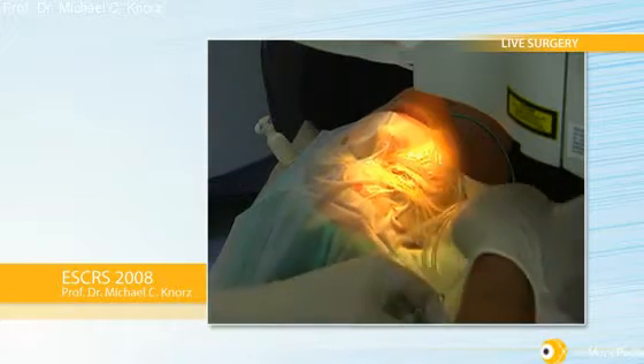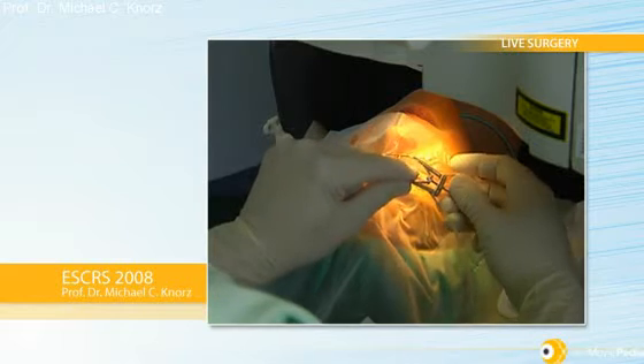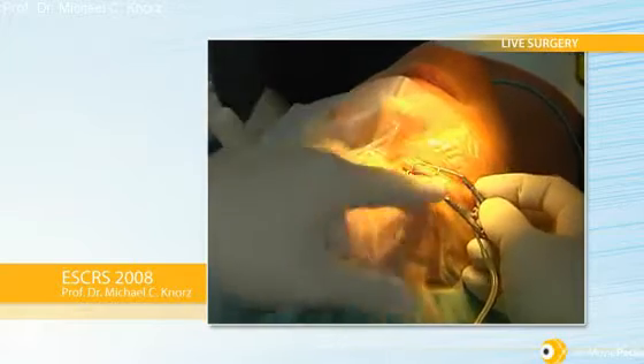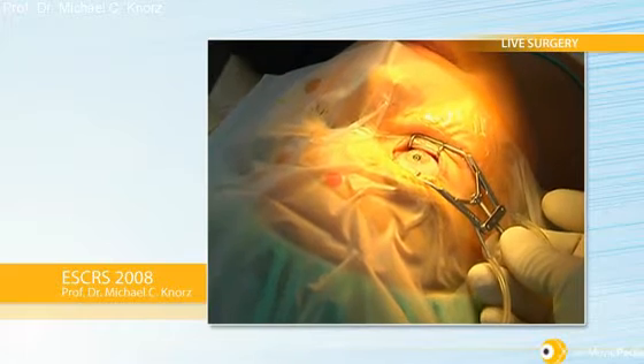This is a very nice combination — using the Visex and the new IFS — because you just swing the arm from one to the other. Now I introduce a lid speculum; this is an aspirating lid speculum, which keeps the eye pristine after the treatment because it can irrigate and aspirate.